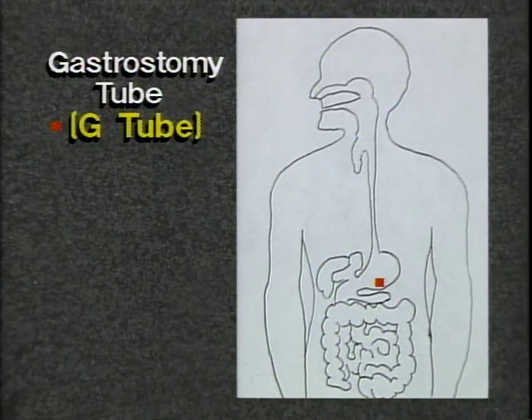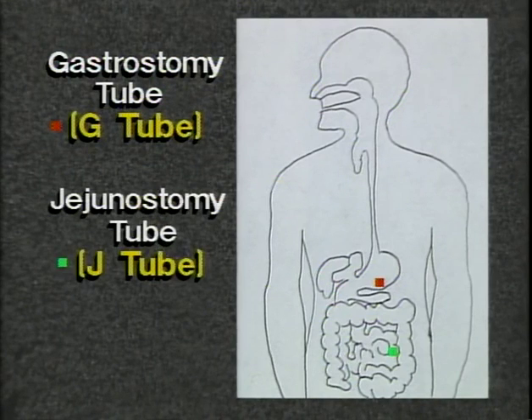Enteral nutrition can also be administered through a tube surgically placed in the patient's abdomen. It is called a gastrostomy tube or G tube if it goes into the stomach, and a jejunostomy tube or J tube if it goes into the small intestines. The insertion site is called a stoma. The gastrostomy and jejunostomy tubes are for long-term therapy. These tubes are generally less difficult to maintain and pose less risk than the NG tube, but they must be inserted in a hospital facility, often utilizing local anesthetic during the procedure.